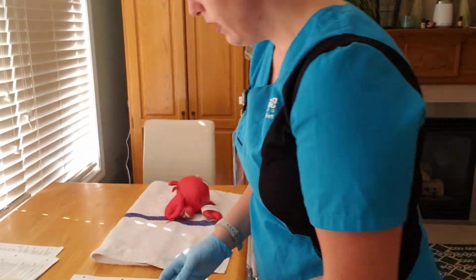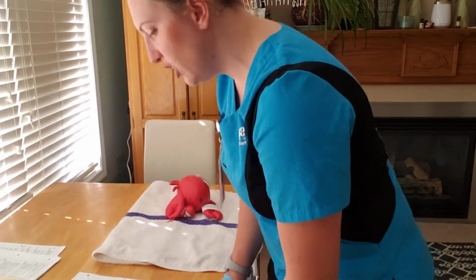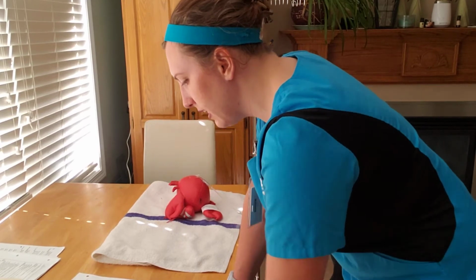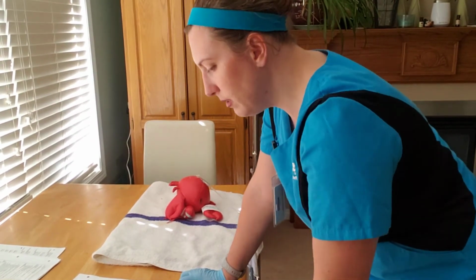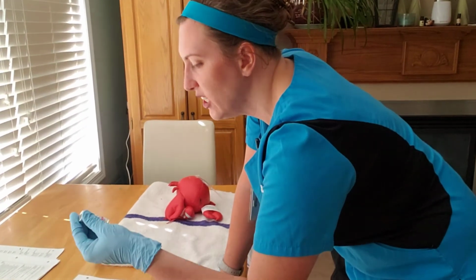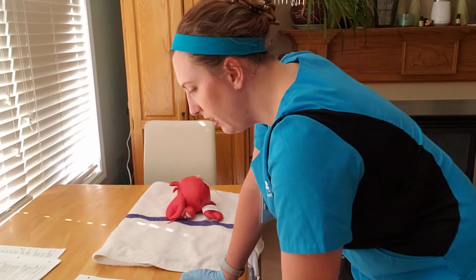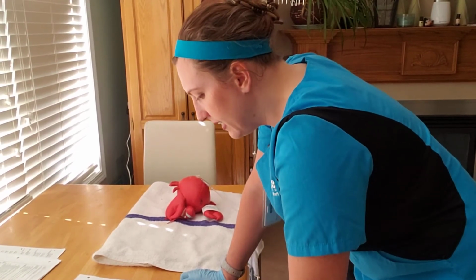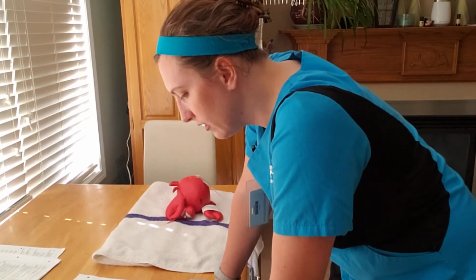Okay. So now I'm going to do my third check here. I've got ranitidine in my bag, ranitidine in the vial, and ranitidine on my MAR. 50 milligrams, and I know I injected 2 milliliters, which is 50 milligrams. It's for IV on the vial, and IV on the MAR for today's date, June 25th at 0700 hours.